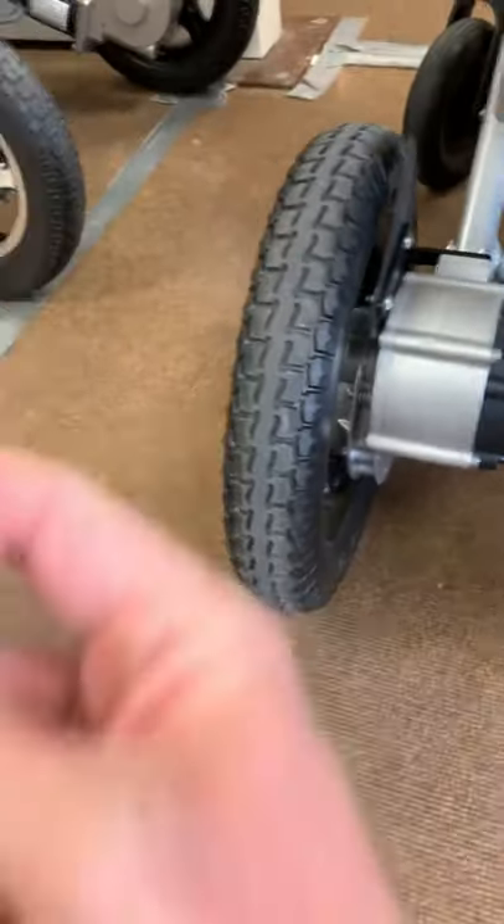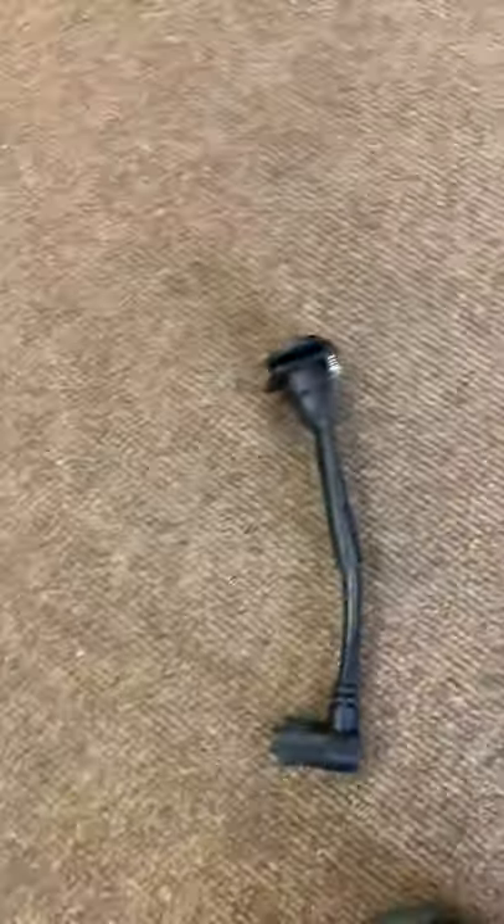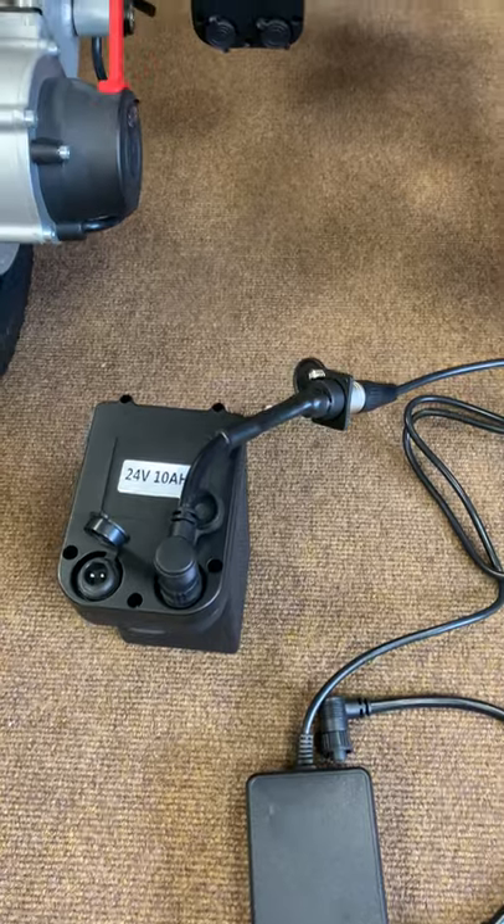If you want to charge the batteries, you can charge one battery off the chair. This is what your charger looks like — this end goes into this lead, which then goes into your battery. That's what it looks like charging your battery off the chair on the X.